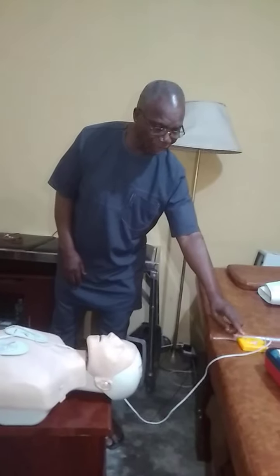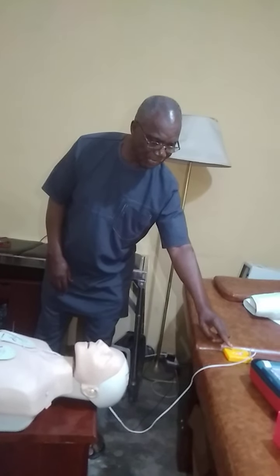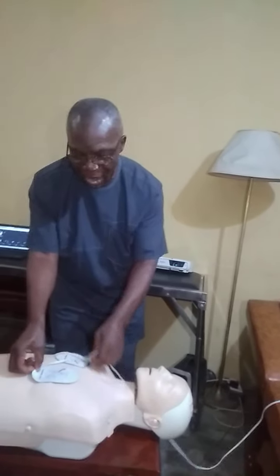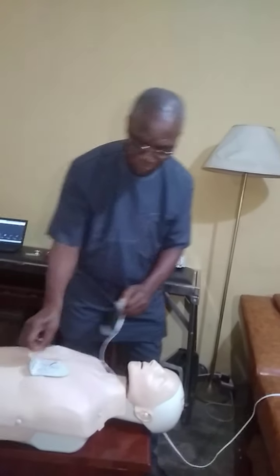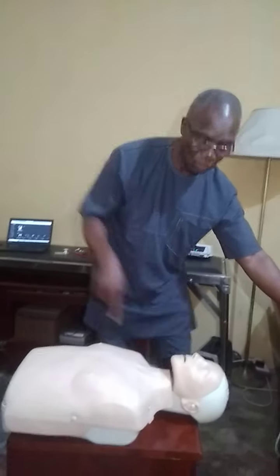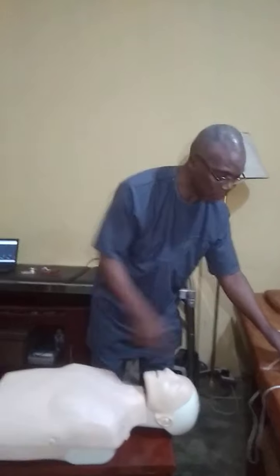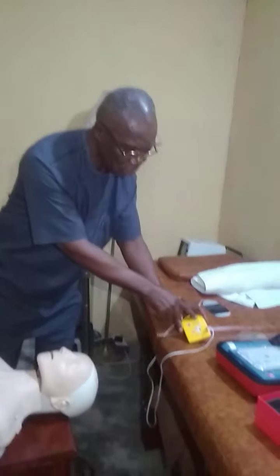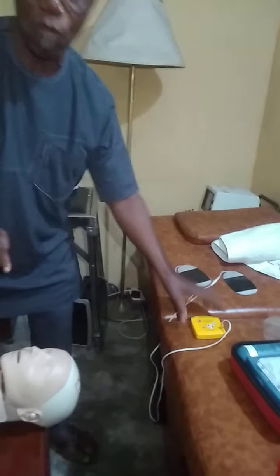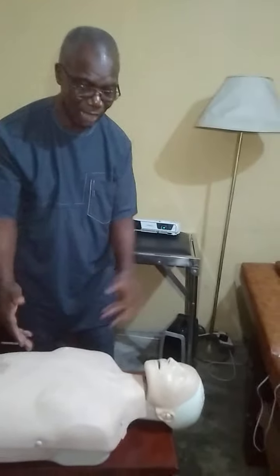I'm being advised to deliver shock. So I'm pressing the yellow button. Shock has been delivered. It's now telling me to go on with CPR even after the shock. So you just simply follow the instruction. You follow the instruction while it is going on. Where I'm going to do the CPR, I'll continue with the CPR. Remember, it's still going on, showing indication, being prepared for another analysis, analyzing and all.